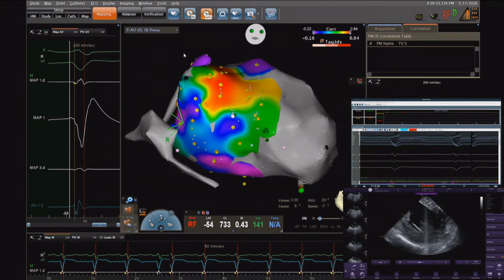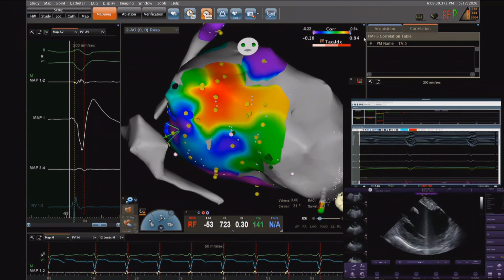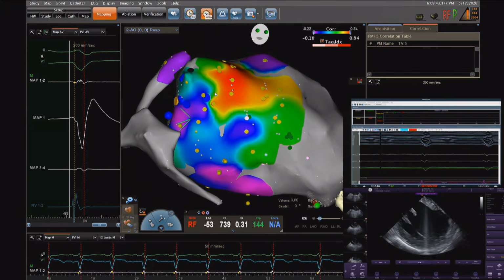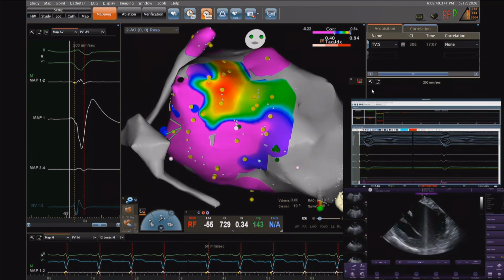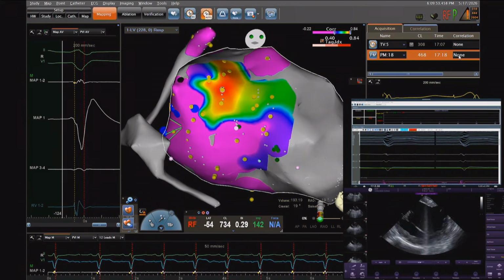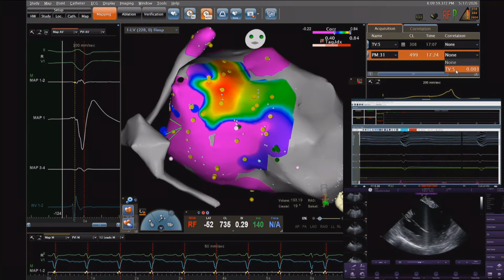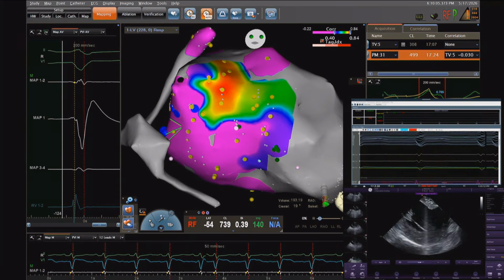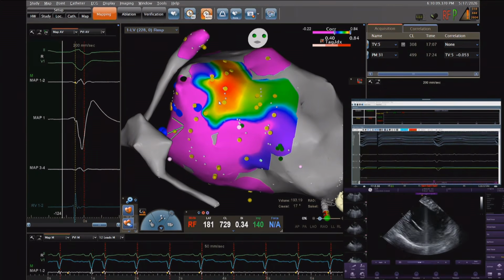circuit. If you look at the pacing sites, which are very good here in red, 84, you see that there is a gradient. If you go below that, you go from red to blue, so it means that the percentage of correlation goes between 84 and 40 in a very small distance. So there is some conduction delay here between this zone and the rest of the septum. And it fits with this wall thickness, which is thin, in this whole anterior wall here.